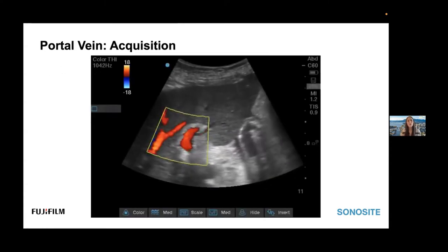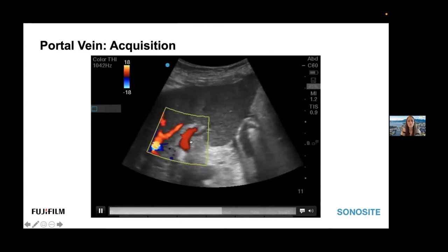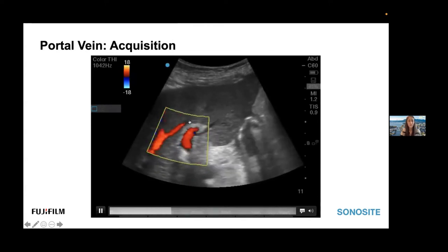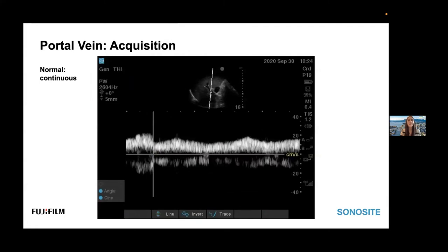Moving on to the portal vein. You can obtain this scanning subcostal along the costal margin, but I find it much easier from a lateral approach in a coronal plane. A little bit of fanning and sliding your probe inferiorly will easily identify the portal vein. You can identify it because it's bordered by bright hyperechoic fat with thick walls, and when you put color on you'll see hepatopetal flow flowing towards the probe. Once you've got your vessel identified with color, use pulse wave Doppler and identify this nice continuous flow with some gentle respirophasic undulations — this normal continuous low-grade flow is what we're looking for.